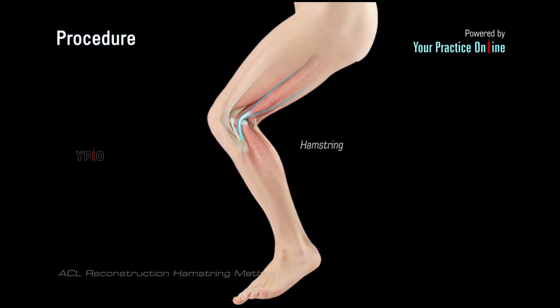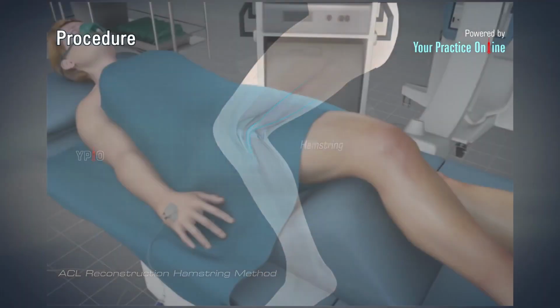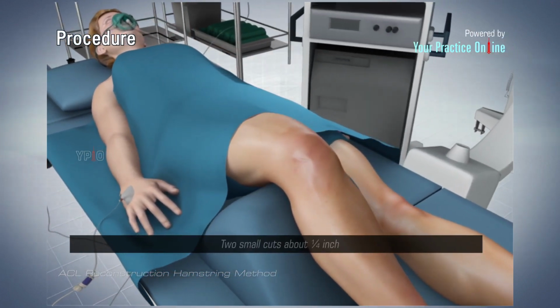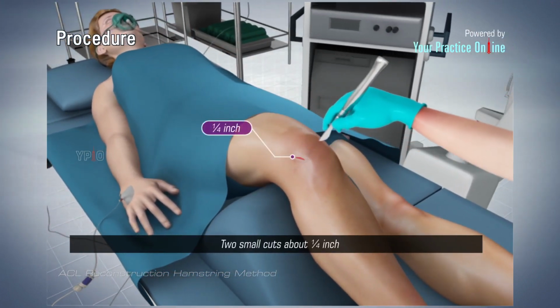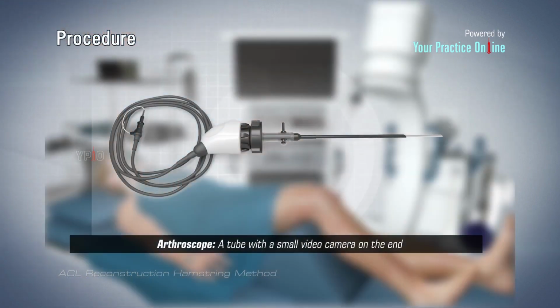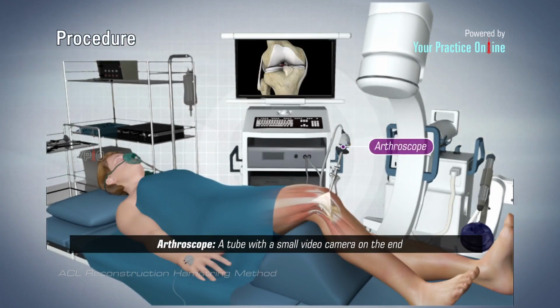Procedure. The goal of ACL reconstruction surgery is to tighten your knee and to restore its stability. The hamstring is the muscle located on the back of your thigh. The procedure is performed under general anesthesia. Your surgeon will make 2 small cuts about 1/4 inch long around your knee. An arthroscope, a tube with a small video camera on the end, is inserted through one incision to see the inside of the knee joint.